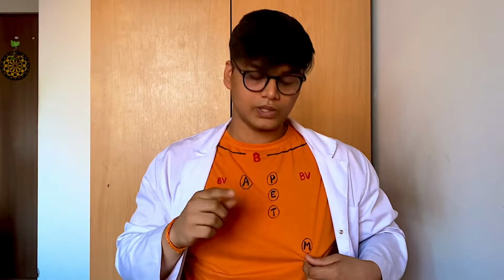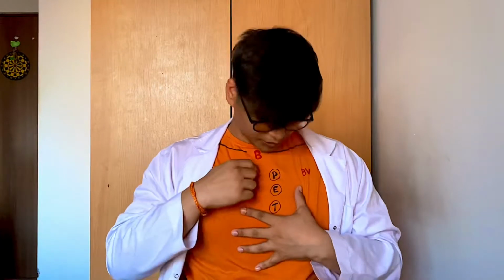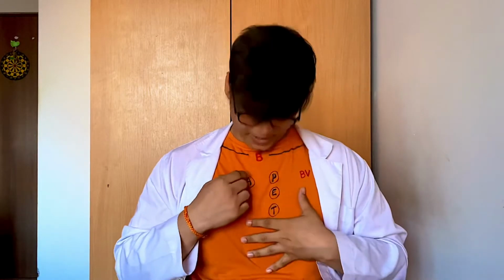For the S1 sound, that is the first sound of heart, you will hear it louder at tricuspid auscultation point and mitral auscultation point. And the S2 sound, which is the second heart sound, you will hear it much louder at the aortic auscultation point and the pulmonary auscultation points, because the first heart sound comes when the mitral and tricuspid valve closes, so you will hear it louder here, and the S2 is when the aortic and pulmonary valves close, so you will hear it louder here.